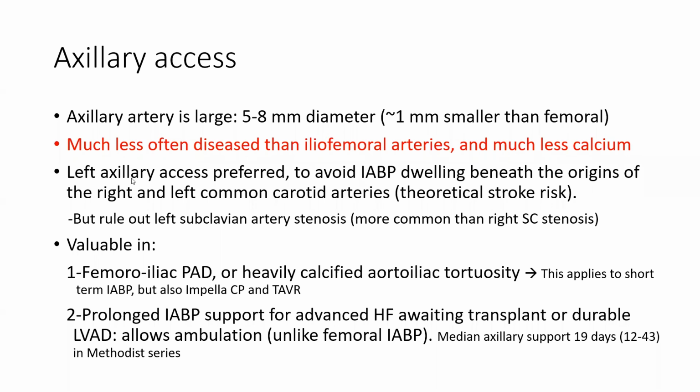In general, the left axillary access has been preferred in most cardiac series. This is to avoid the balloon pump dwelling beneath the origins of the right and left common carotid arteries, which exposes the patient to a theoretical stroke risk.